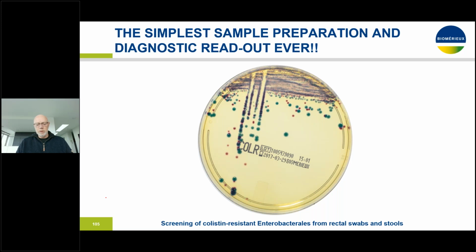There are technologies that are suited for single cell mass spectrometry, but these use equipment and technologies and protocols and procedures which are to date not amenable and not compatible with clinical care. It should be quick, cheap, and high throughput, and these are the three criteria that are missing with this new category of mass spectrometry applications. I will get back to that at the end of the story. But this is important. You need to realize that before your MALDI analysis, in most cases, you need to biologically amplify the organism that you want to identify and characterize with respect to its antimicrobial susceptibility level.